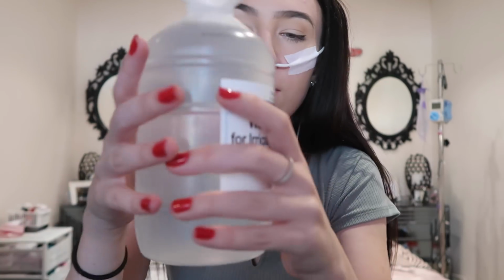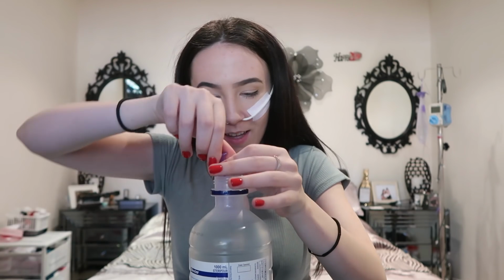Now we're just going to head to the bathroom quickly, and what we're going to do is run the tube under warm hot water, and we're going to flush it with some sterile water. So I'm going to open up this. This is just water for irrigation, not for injection. I'm also just going to have a quick sip because my throat is a bit sore now, just to ease the throat. So I'm going to open up this syringe. I'm just going to get it.